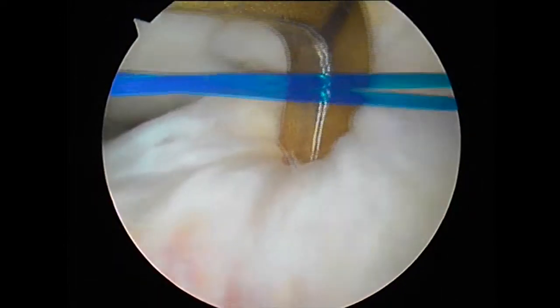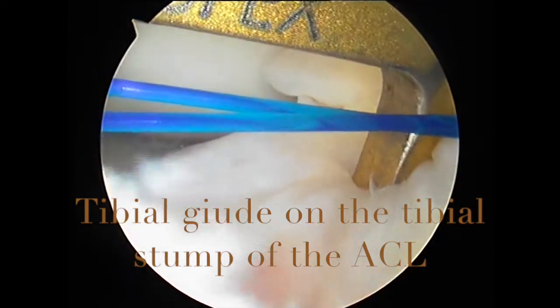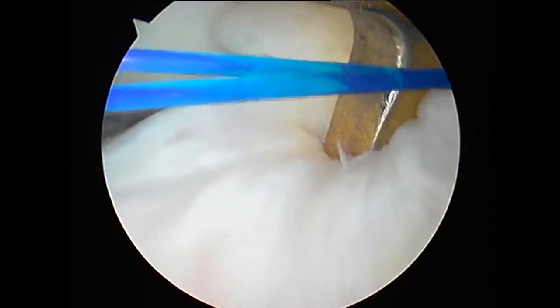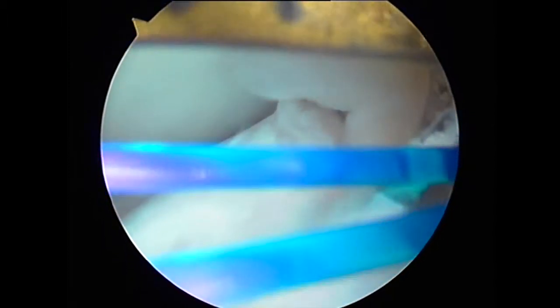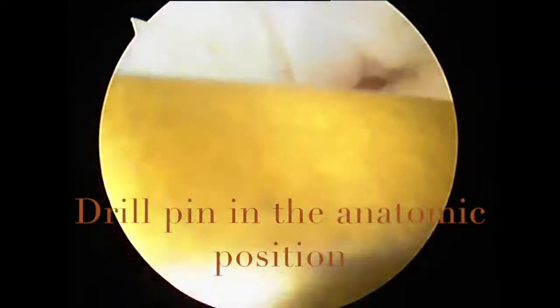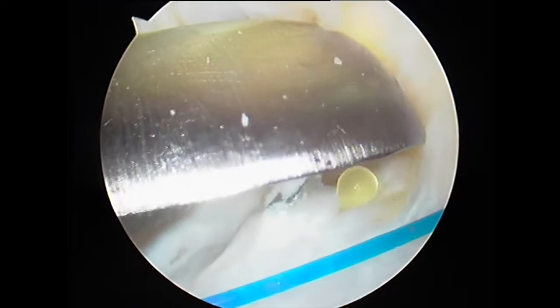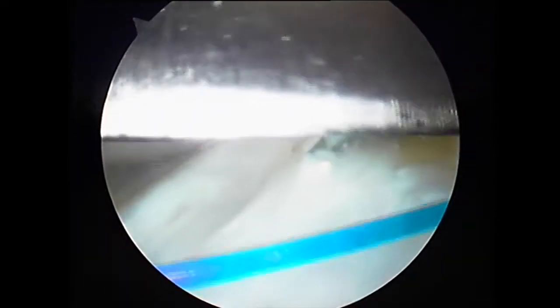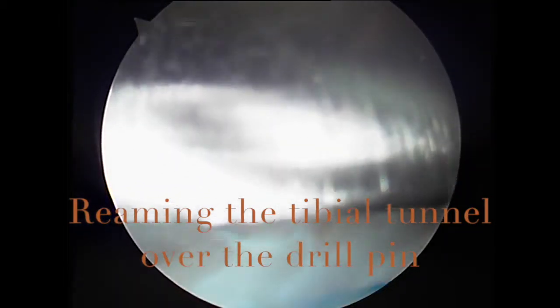On the tibial side, we choose a central position within the anatomic footprint of the anterior cruciate ligament. This is usually posterior to the anterior horn of the lateral meniscus, slightly shifted towards the medial tibial spine, which has some attachment to the fibers of the anterior cruciate ligament. We drive the pin from outside in, making sure the drill pin occupies a central position within the tibial remnants of the ACL. It is important to remember that if this drill pin is anterior or outside the anatomic placement, it can cause impingement with the superior part of the femoral notch and hinder the range of movement.